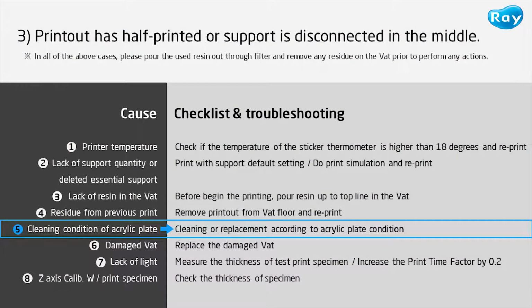When you wash it, please be noted that the acrylic plate absolutely has to be cleaned with water and water only. If not, the surface will turn blurry and not be usable anymore. A highly contaminated acrylic plate may cause distortions on printouts.